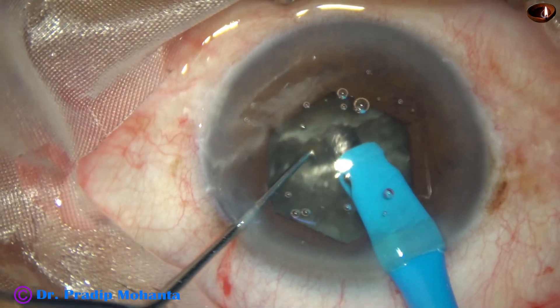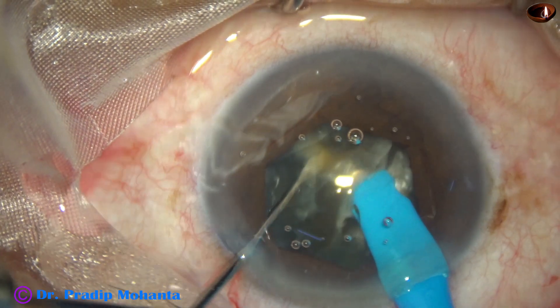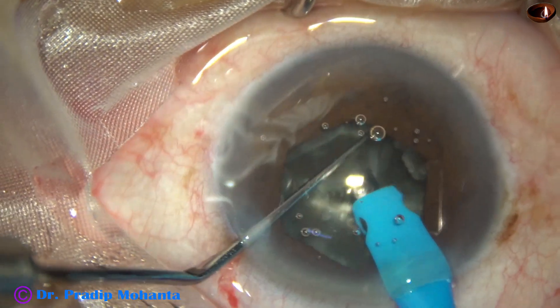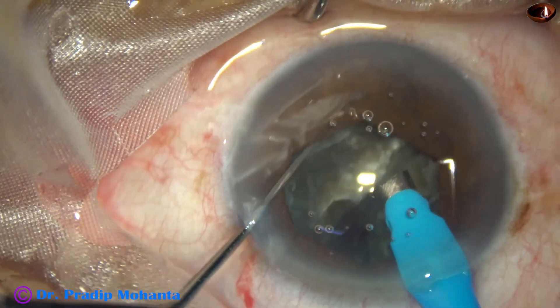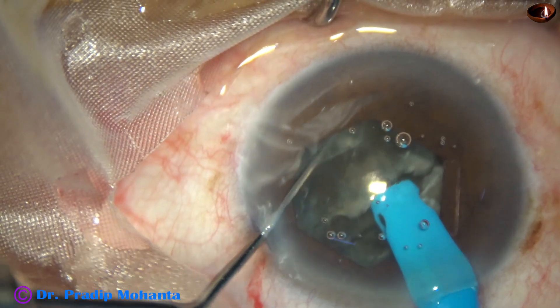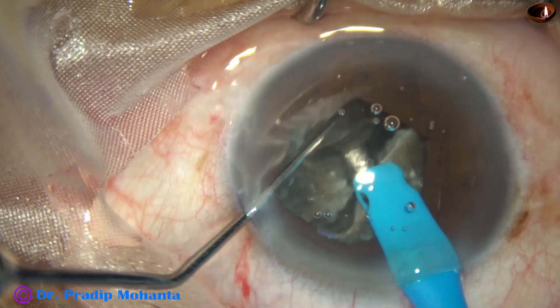Each hemi-nucleus is then chopped from within. The chopper is a modified Sinskey hook known as the Mohanta chopper — slightly thicker and a little longer than a Sinskey hook. After chopping both hemi-nuclei, I have four free nuclear fragments.